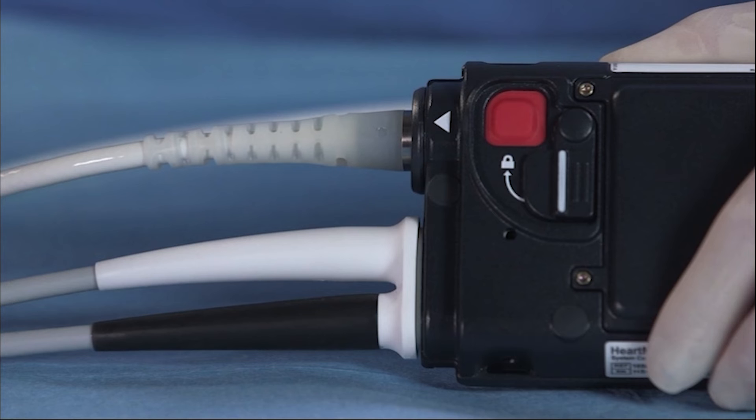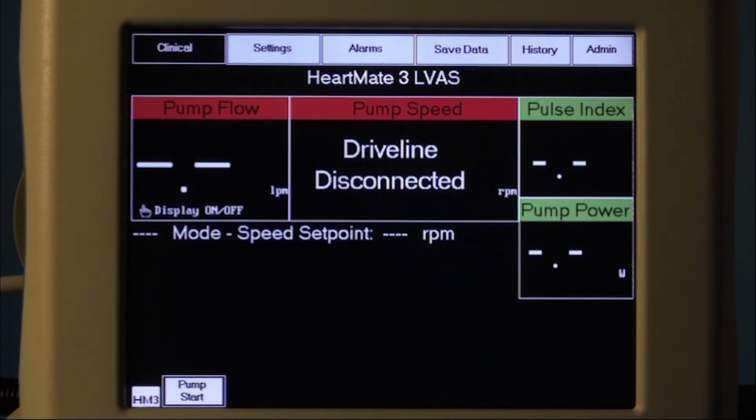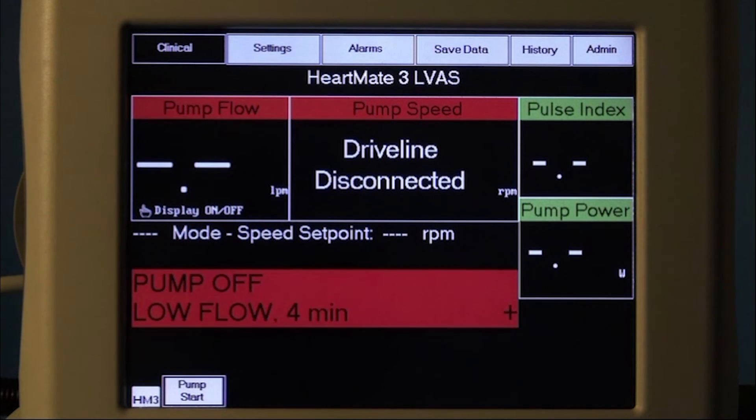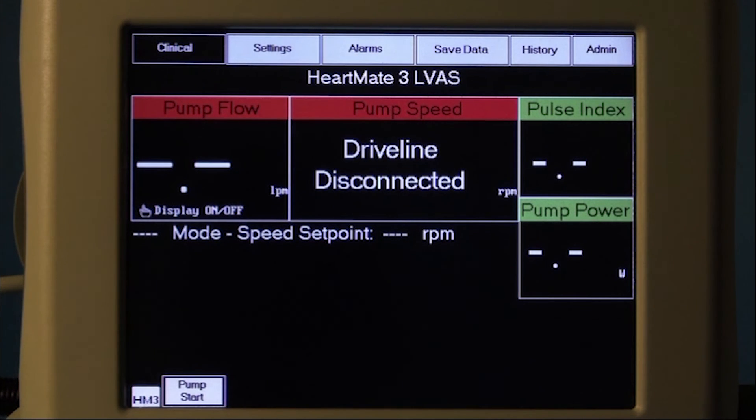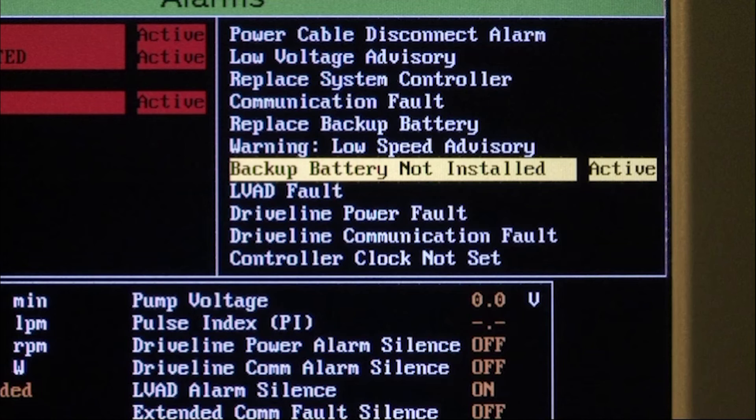Then close the safety lock on the back of the system controller. System controller setup is now complete. The driveline disconnected alarm message will remain until the system controller is connected to the LVAD. The pump off and low flow alarm messages will remain until the LVAD is turned on with the system monitor pump start command. The system controller backup battery not installed alarm will remain active until the backup battery is installed in the controller prior to leaving the operating room.